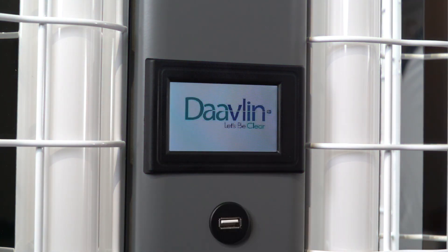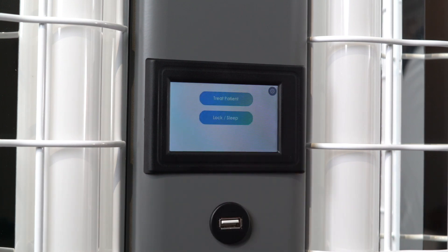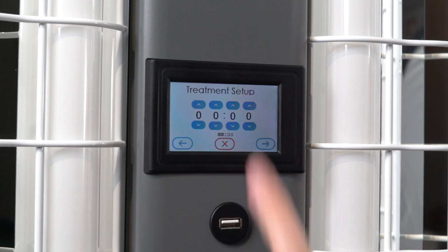To begin, touch the screen to awaken the unit. The Daavlin logo will appear—tap it. A numeric keypad will then appear. Enter your unlocking PIN code followed by the arrow key. Next, press the Treat Patient button.